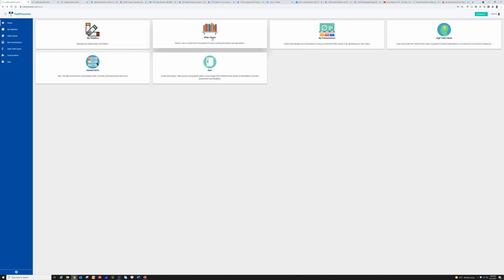So it's a great place if you're like, well, I don't have a good example of entity X, come and check the slide library on Path Presenter, and then you can share that and use it for teaching. And you can share individual slides, or you can build presentations.